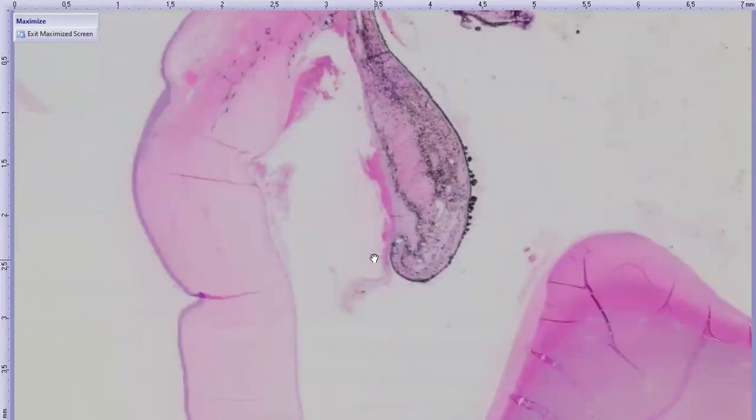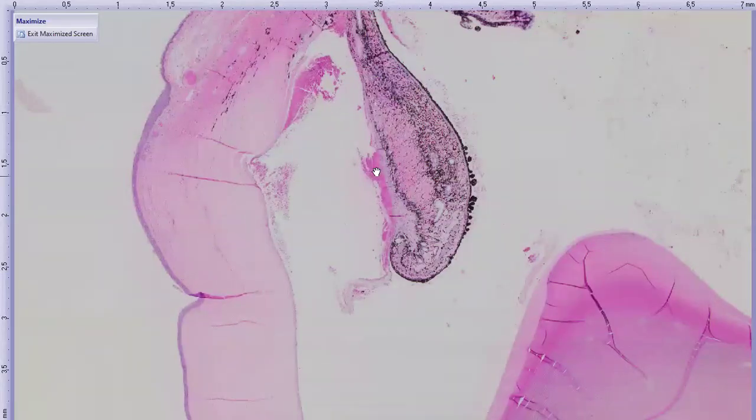Move to the other side. I think this shows maybe that membrane a little better, and a slightly more mild ectropion uveae. There's a little bit of hemorrhage in the anterior chamber, potentially just associated with this fibrovascular membrane. They do like to bleed.